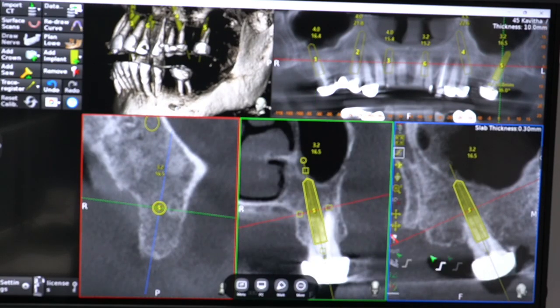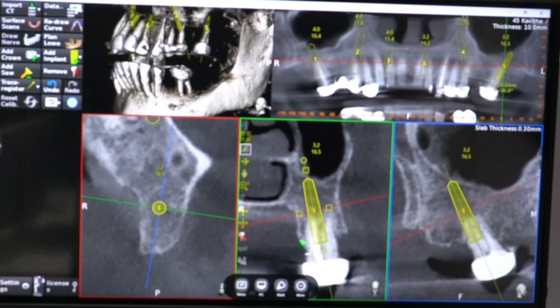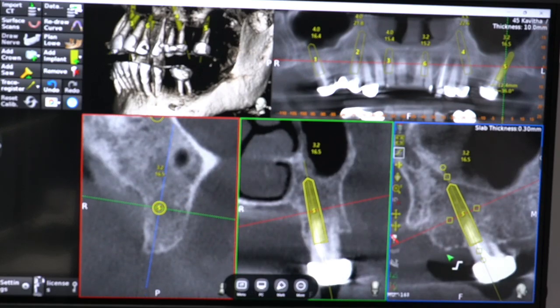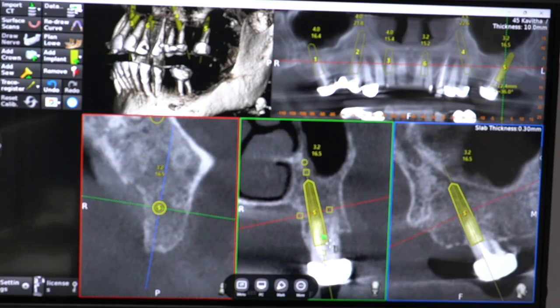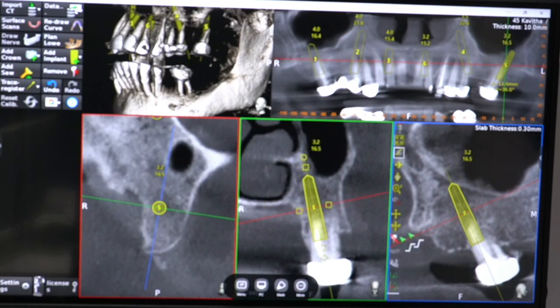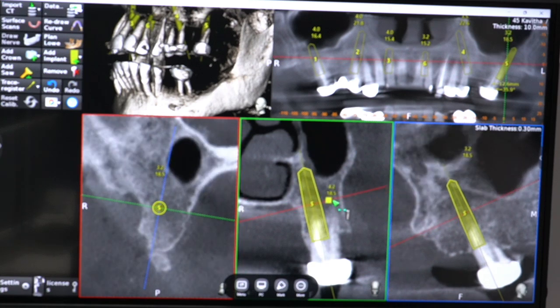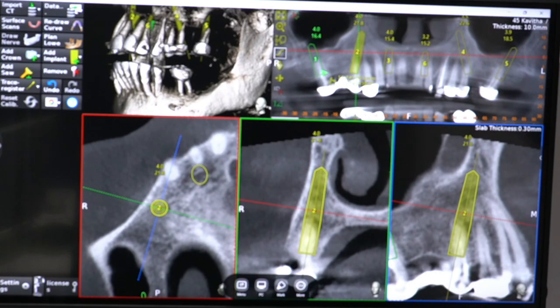Okay, so on the left side luckily it is a multi-rooted tooth, the right side is a conical root. Whenever a conical rooted molar is there, the implant placement is challenging. Here the palatal root is there, multi-root. So when the palatal root is there, it is a good scenario because the palatal socket itself is cortical bone, and we are aiming towards that palatal bone. Easily we are getting 18-20 mm. Okay, so pterygoid is not needed.